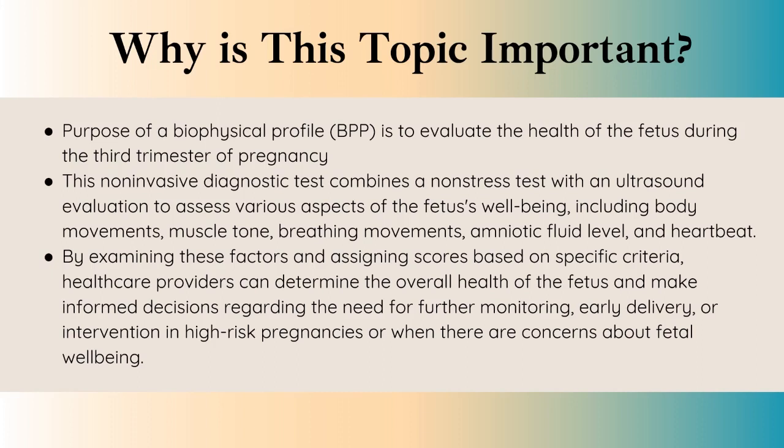By examining these factors and assigning scores based on specific criteria, healthcare providers can determine the overall health of the fetus and make informed decisions regarding the need for further monitoring, early delivery, or intervention in high-risk pregnancies, or when there are concerns about fetal well-being.